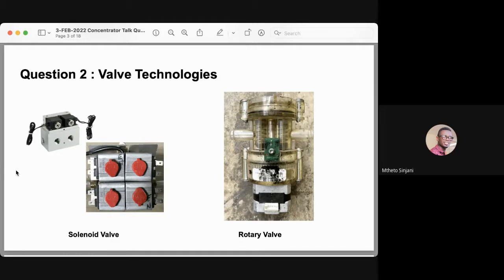All the valves perform the same task of feeding the compressed air to the sieve beds, wasting and purging air from the sieve beds, and equalization between the 2 sieve beds. So the issue you are experiencing is not common, but the following is a good step-by-step troubleshooting procedure.